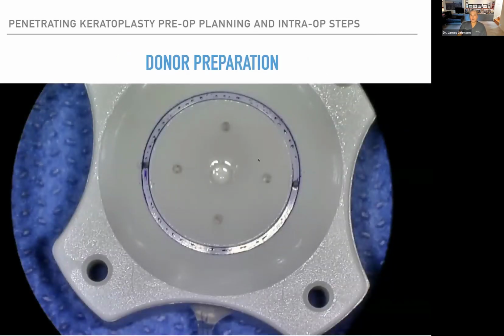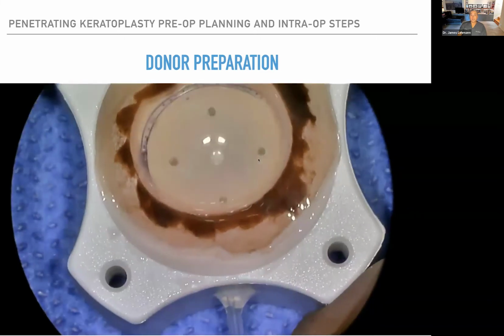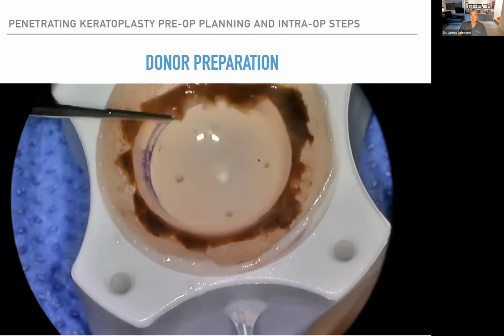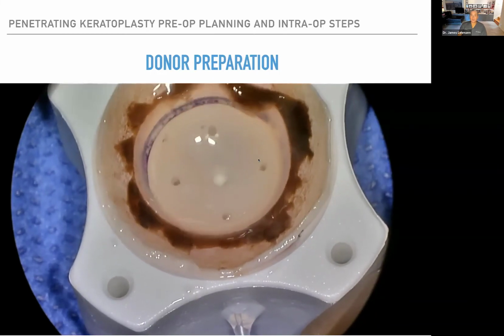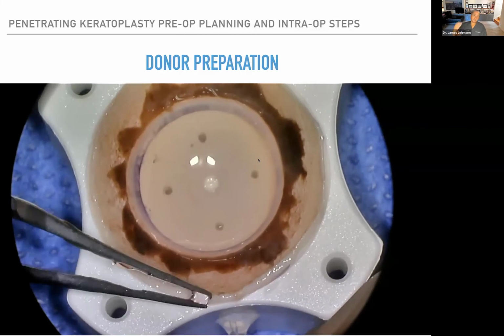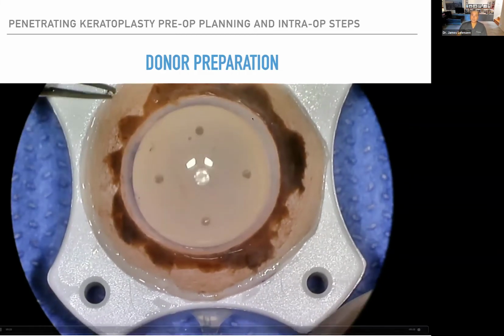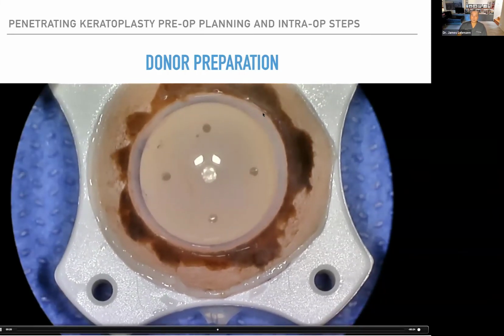Okay, we're going to move to donor prep. I have a vacuum trephine here, but I don't use the vacuum. I do put a marker, and I mark that purple ring because it helps to center better, especially if they have arcus. Now I'm moving the uvea out of the way, and I want to be able to see that whole purple ring there. That means I'm centered, and I'm not going to do an eccentric cut. So now I can see the whole ring. You can see a little arcus right here on this side.